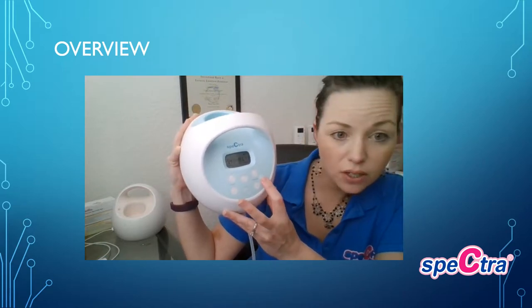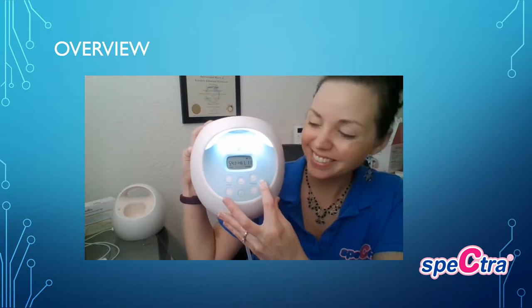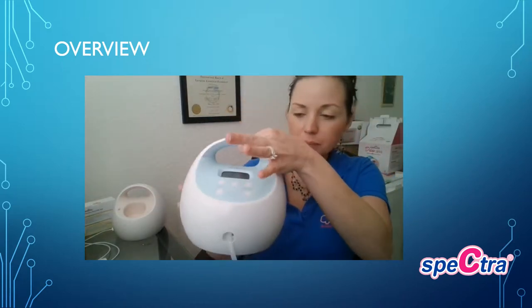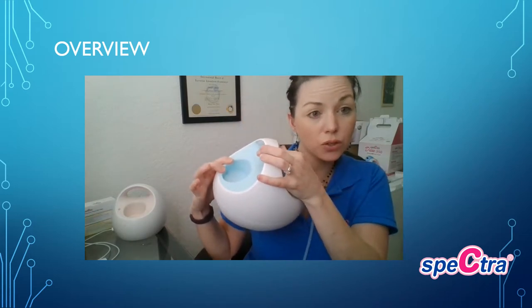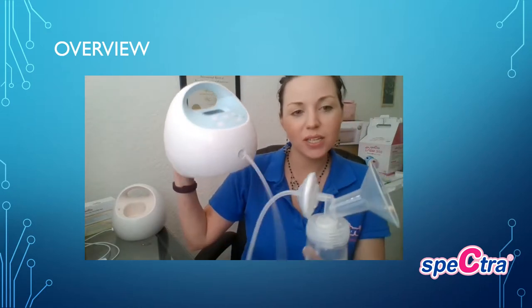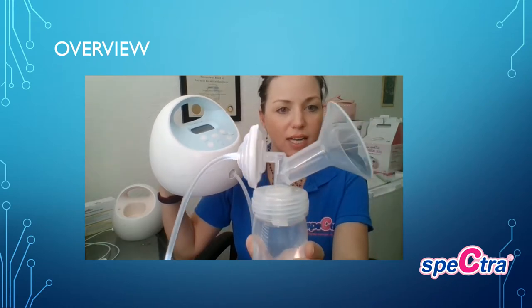There is a two-level nightlight which is wonderful at night. There is a handle for easy portability and a holder in the back that you can use for your backflow protectors or bottle. You will notice that the actual backflow protector is moving in rhythm with whatever your settings are for your pump.